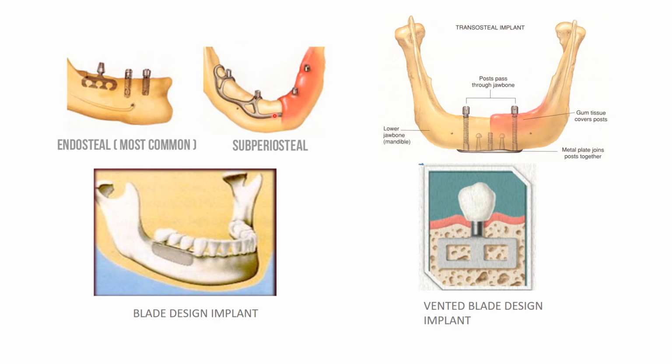These implants involved a lot of morbidity, a lot of extensive surgery, and patient compliance was less. There were a lot of chances of infection later, and hypertrophic gingival growth, and also chance of failures and paresthesia of the inferior alveolar nerve or the lingual nerve, or the mental nerve was always there. And with this option, there would be settling or the sinking of the implant would also take place. So these implants were basically discontinued after some time. Now again there has been some emergence in the usage of subperiosteal implants, especially in cases of cancer and mucormycosis where we don't have other options to place endosteal implants.